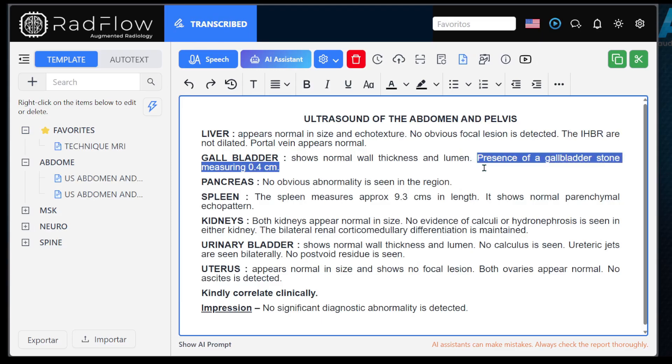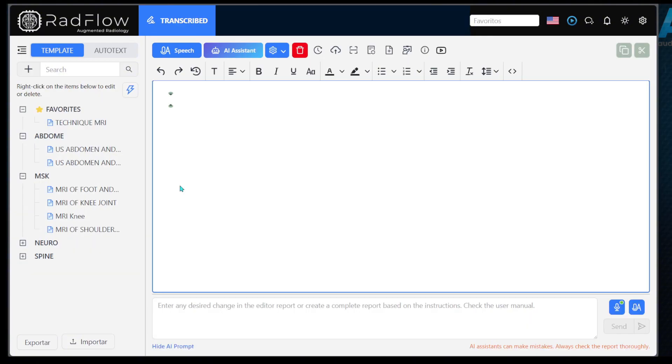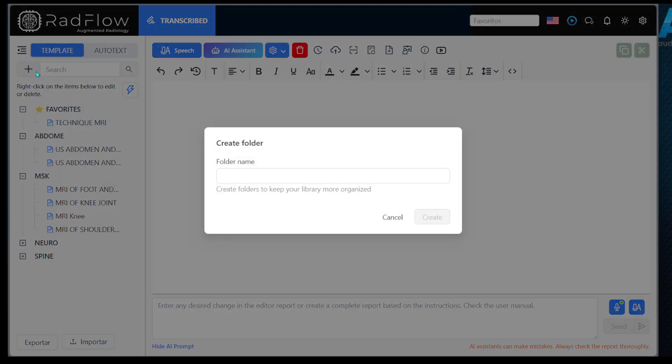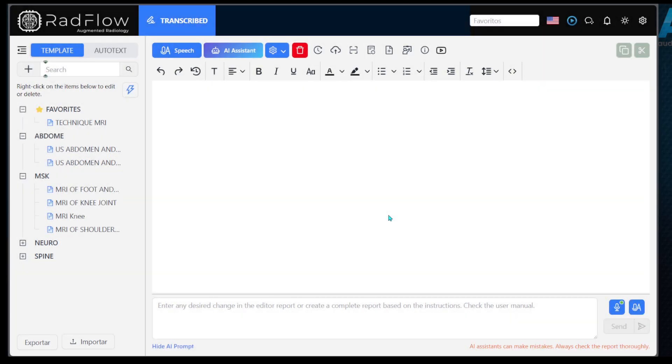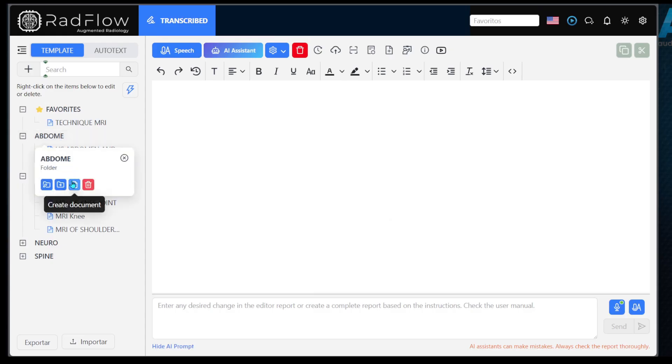Now let's understand how to create customized templates. On the side menu, you will find the option to create custom templates. To add a new template, click the plus button in the upper corner to create an initial folder. Then right-click on the folder and select create document.